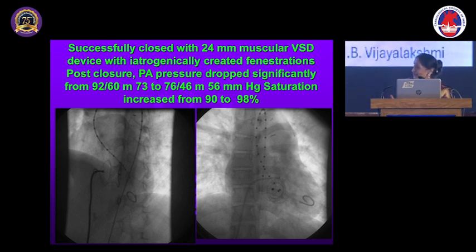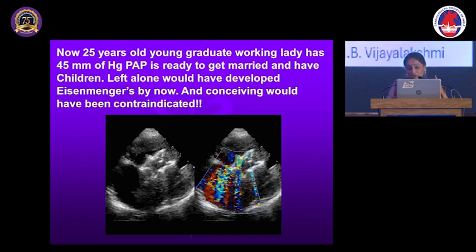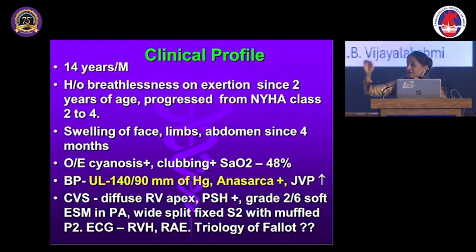Would you like to do the surgery, or the intervention, or leave her alone to go for Eisenmenger's? I am always an experimental person. Apart from the drugs, I did try the device closure. Before that, to avoid a suicidal RV, I opened the PFO with the Tyshak balloon, so that if the RV pressure goes up, a right-to-left shunt vent is there. That is the first precautionary measure.